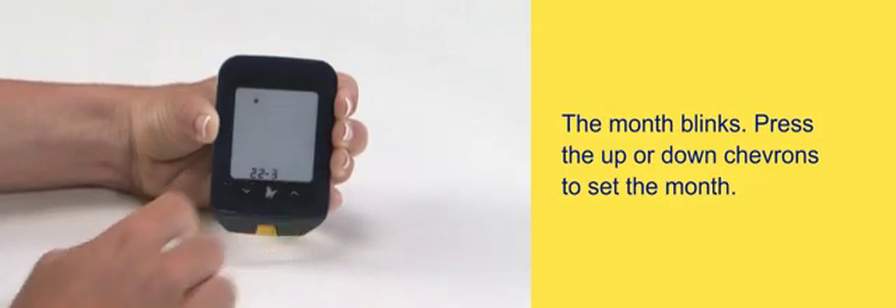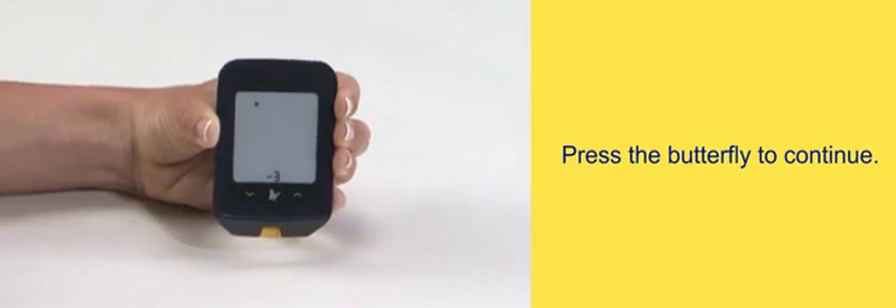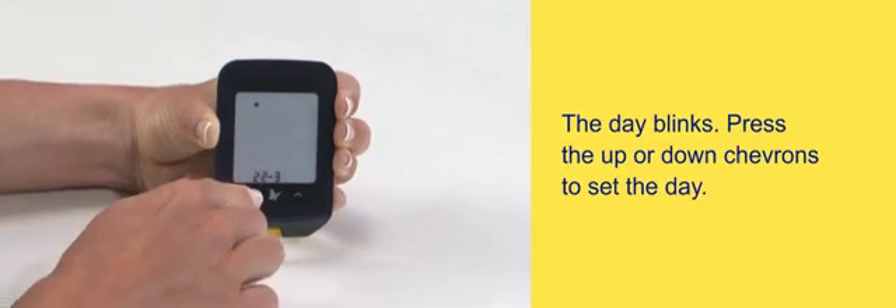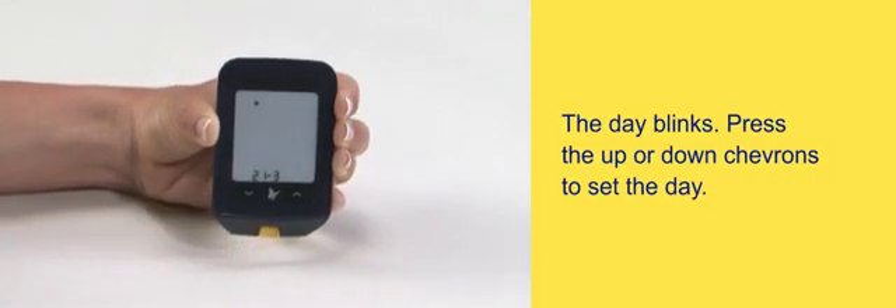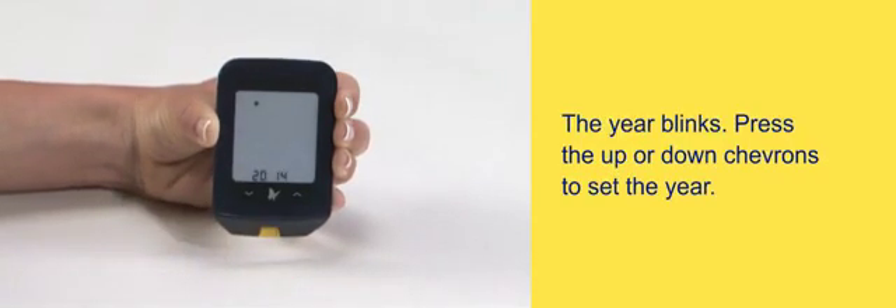Press the up or down chevrons to set the month. Press the butterfly to continue. The day blinks — press the up or down chevrons to set the day. Press the butterfly to continue. The year blinks.